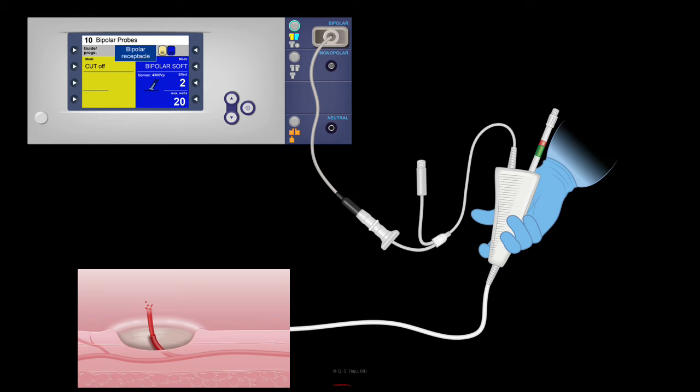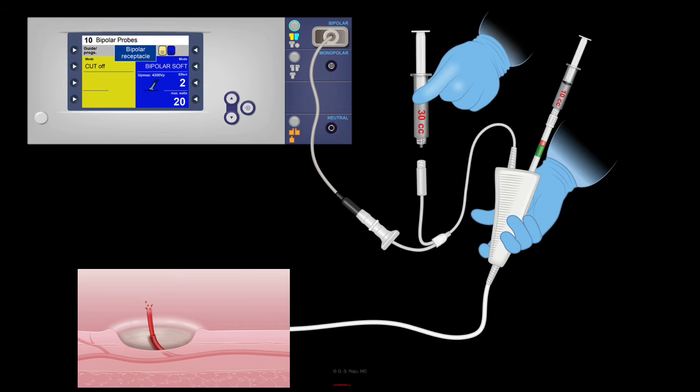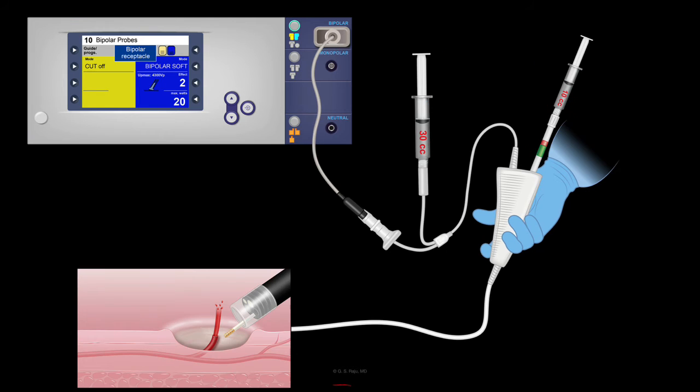But before we go there, let me share with you some of the other things that you could do with this bipolar device. You could inject epinephrine or flush saline to clear the blood. This bipolar device can come on its own or with a needle as you've seen here. The needle can be used to inject epinephrine to create vasospasm and slowing of the blood flow before the probe can be used for coaptive coagulation and arresting the bleeding.